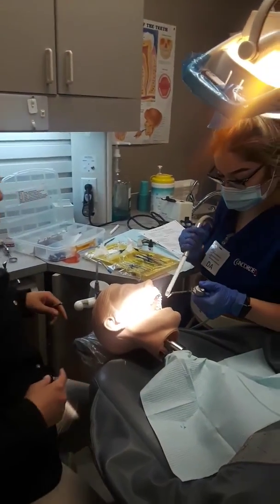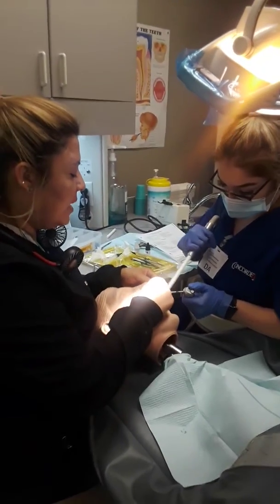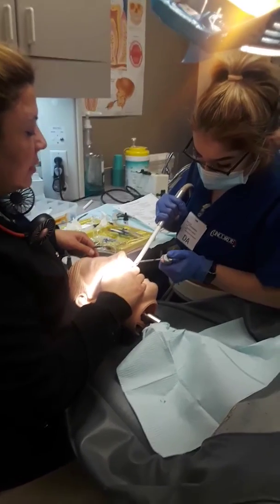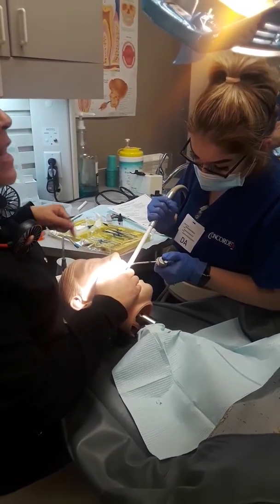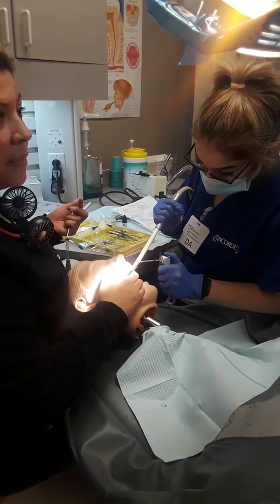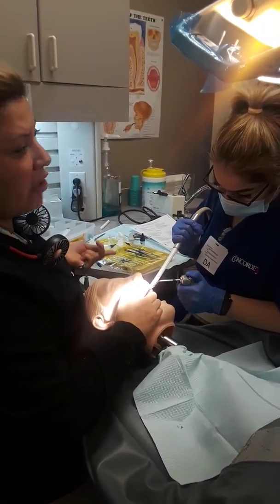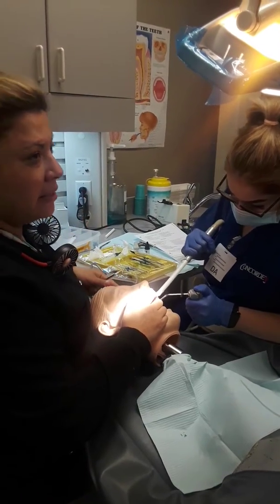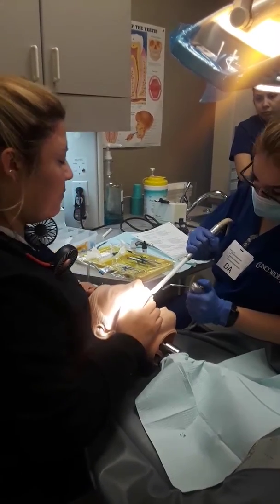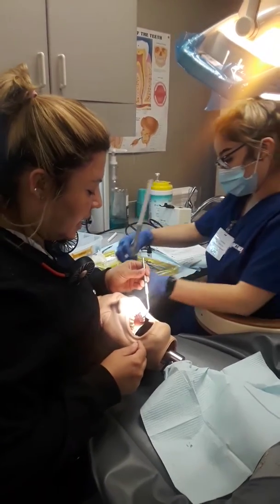Count in your own head and hover like her. I'll assist because my matrix gets in the way. The reason we put the matrix on first is because it causes blood — if I have bleeding in my prep, I have to start over and etch again. That's complete — looks great.